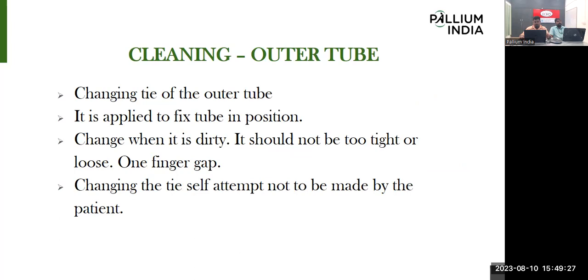Changing the outer tube tie does not need to be done by the patient; only the caregiver, or the patient with assistance, can change the tie from the outer tube around the neck region. It is applied to fix the tube in position only by using this tie.